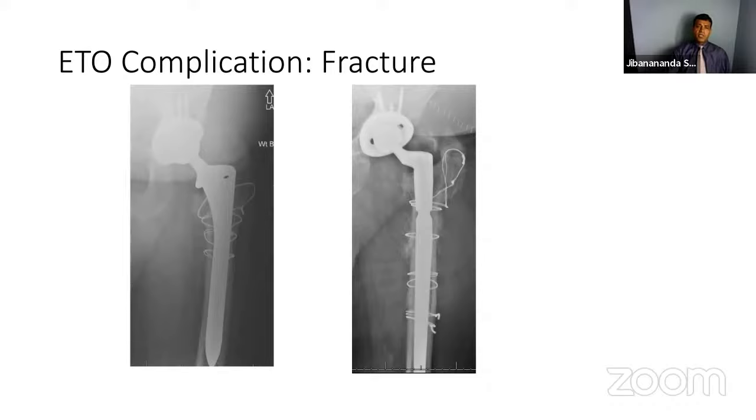But something to be careful about, a complication of ETO with the peri-implant fracture or periprosthetic fracture or a femoral shaft fracture.